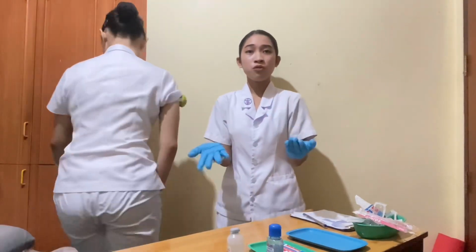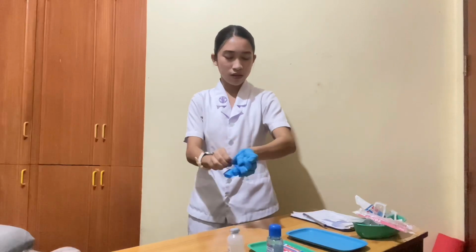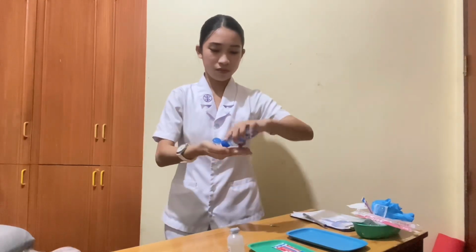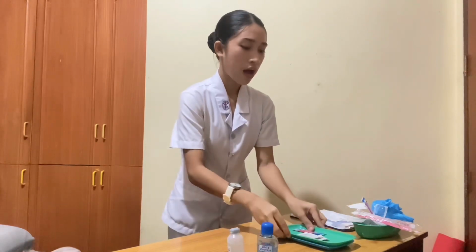Now I'm going to remove and discard the gloves, perform hand hygiene, and do aftercare of the equipment. After that, document all relevant information of the procedure done.